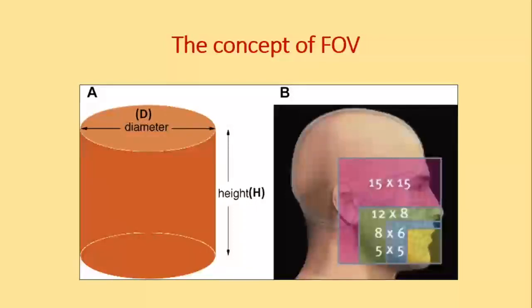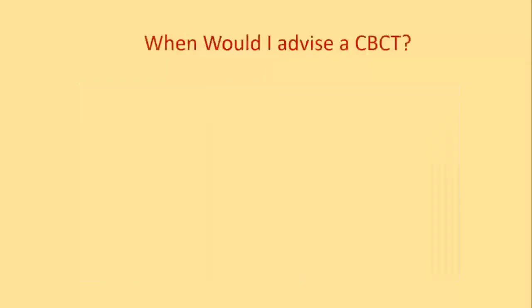This could vary on, like I said, the FOV. And what this actually matches is the volume that's going to be captured. This indirectly relates to the matrix I spoke to you about a long time back, pixels and matrices. So the higher end machines generally have larger scan volumes. That's a takeaway message. But larger scan volumes mean nothing in terms of resolution. Yes, you give me that big picture, but I ultimately want to see that small tooth. So then go for a small FOV.